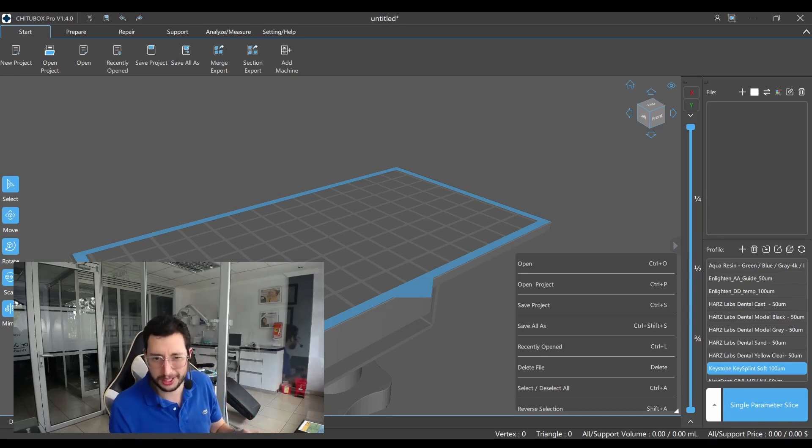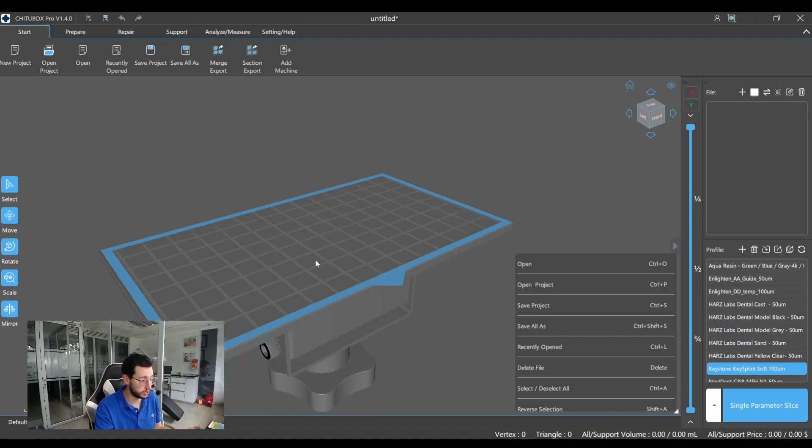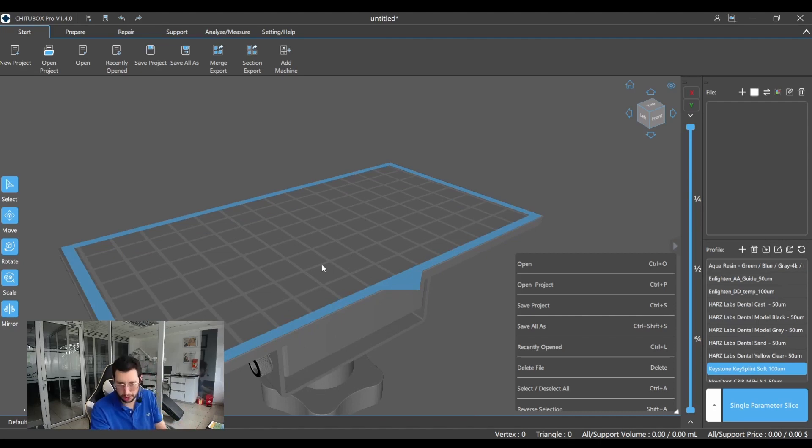When printing dental models, one of the main reasons for printing failure is incorrect orientation or a lack of supports. Today I'm gonna give you a recipe, a simple guide to have perfect dental models every single time. I'm gonna discuss this with ChitoBox Pro, but this can be used in ChitoBox Free as well and works basically the same way.